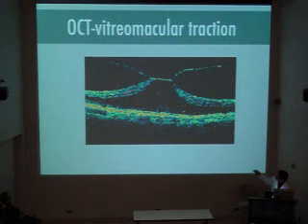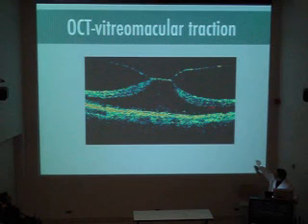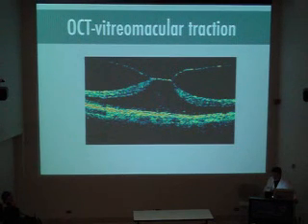normally adherent to the retina, but what's happened in this case, it's very adherent. The vitreous has started to pull, and like a tent, it's lifted the whole retina up. So not surprisingly, a patient like this can't see any details. The amazing thing is, as obvious as this is on this OCT picture, when you look at them with the conventional techniques that we have to examine patients, it's often almost impossible to detect this.